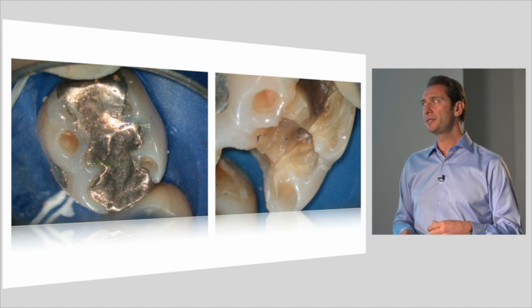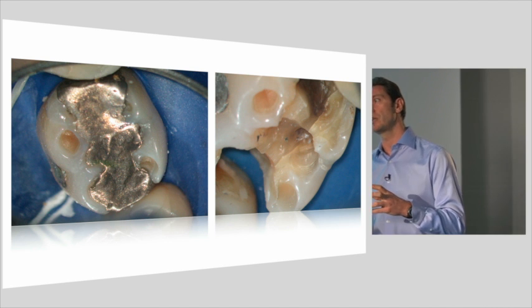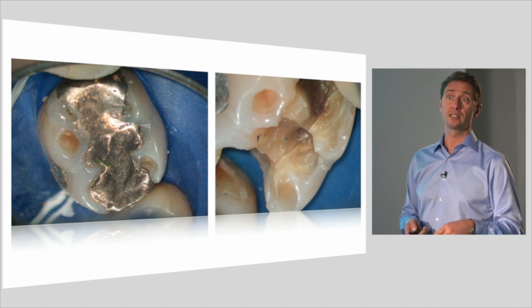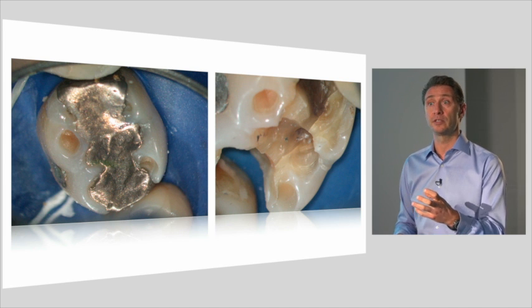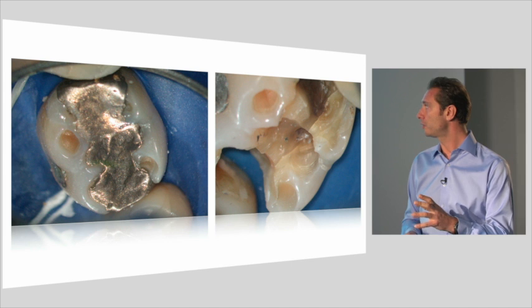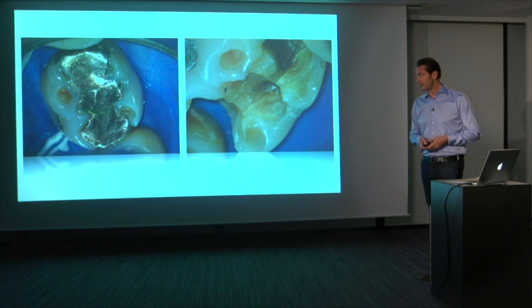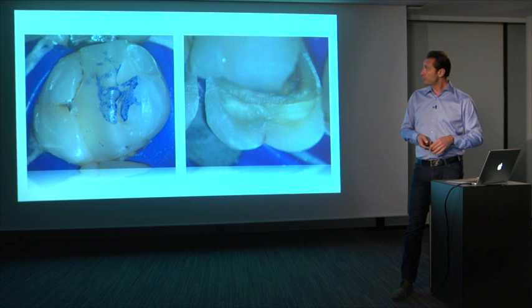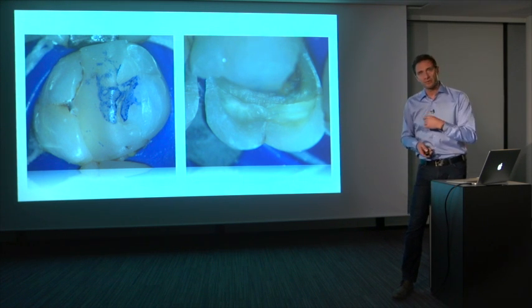So if we will be thinking now about, okay, what material could give us some options in having a better biomechanical approach, don't expect that one material can be the miracle and the solution to all the problems. There still will be some rules to follow in relation to cusp coverage. Another example is this one. As you can see, probably there was some amalgam in this cavity before.